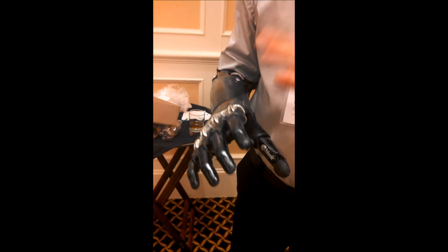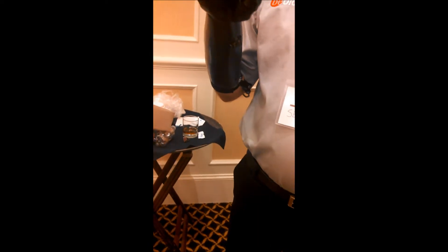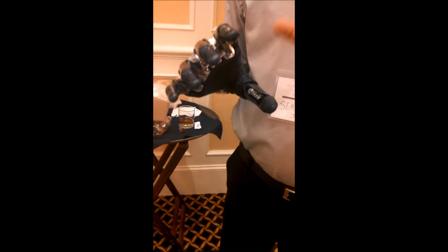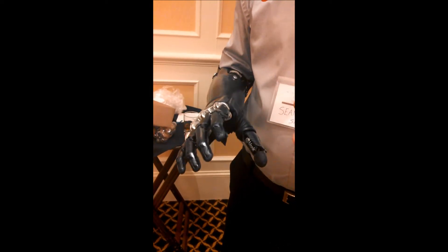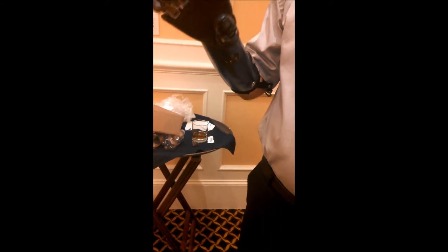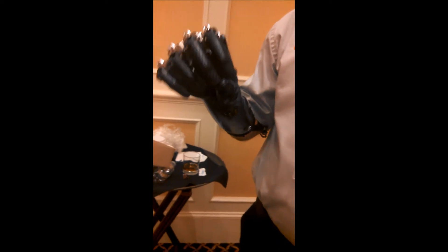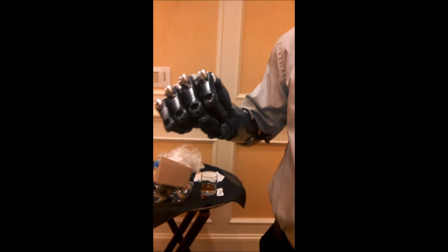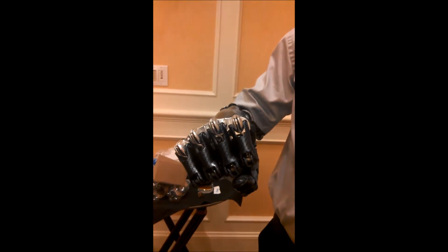Now with the BeBionic hand, what's really cool is initially the myoelectric hands just did that open-close, which was helpful. But these hands now have multiple grip patterns that you can access as well. My primary grip is a tripod grip where the two fingers and the thumb come together. If I come to full open and send another open signal, now I'm in the power grip — you can do a fist bump with that.